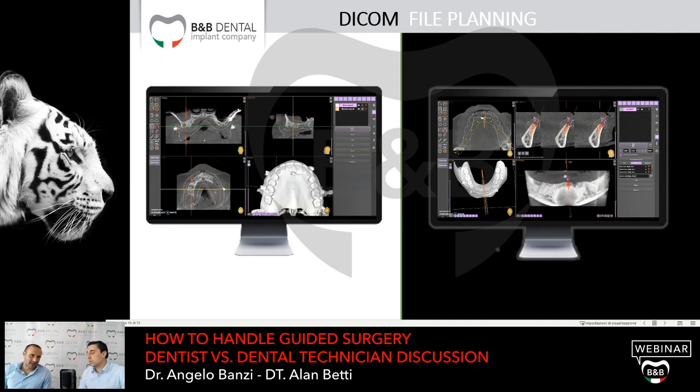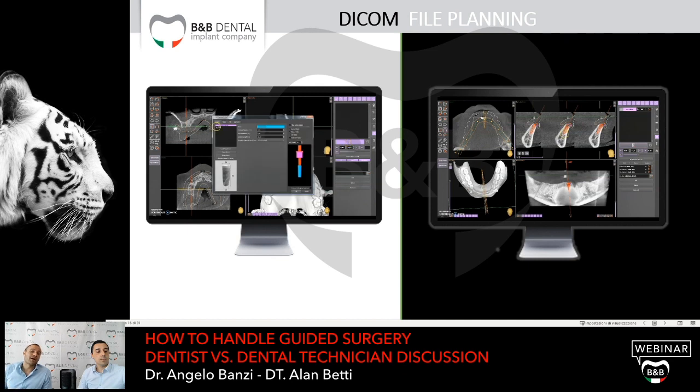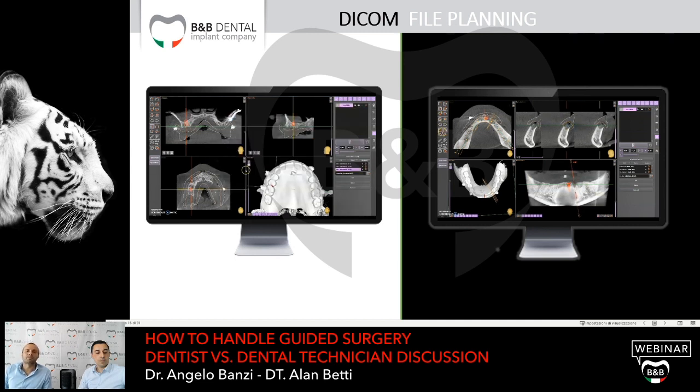The knowledge that the dentist has from his clinical experience. As I mentioned before, you have to place implants differently depending on whether I'm going to fix the prosthesis with a cemented prosthesis, a screw prosthesis, a ball abutment, straight abutment, angulated abutment, or multi-unit abutment.